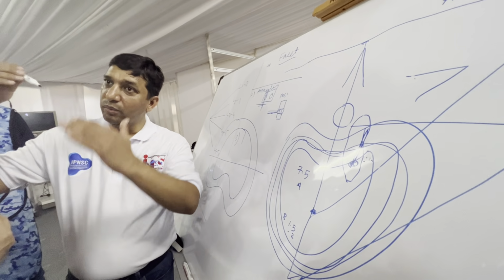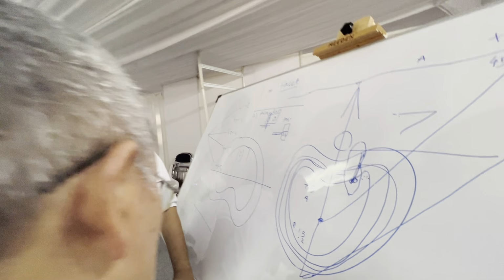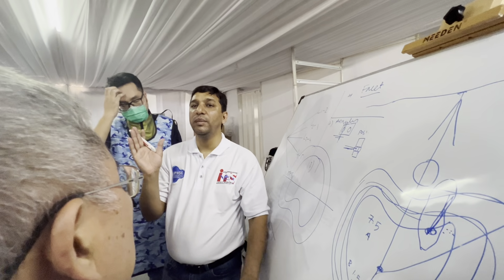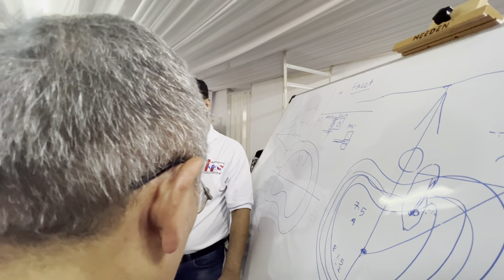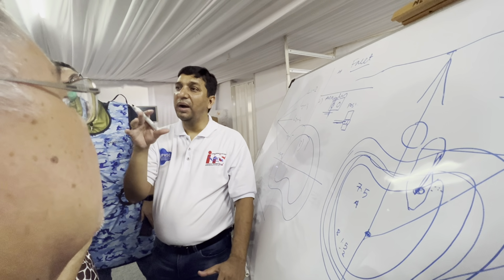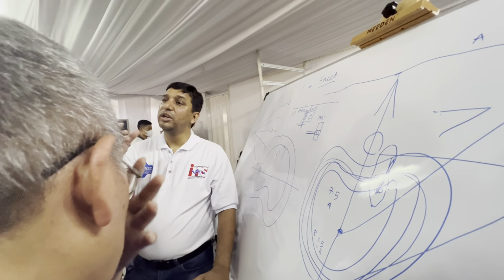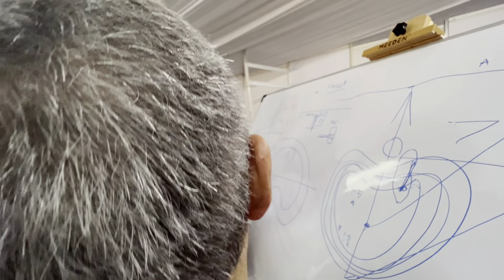So it means you are more posterior, you are more flat, and this will help you at your subannular area. So this is the annulus, so your subannular. You are exactly at the area where the herniation has come out. When you go to this area, you will see, oh wow, this is mostly empty area because the disc from there has come out. Then you just do the decompression and come out, so you become half and half. You see half of the annulus and half of the epidural space, and then you start working on the annulus. Do a good annulotomy under vision.